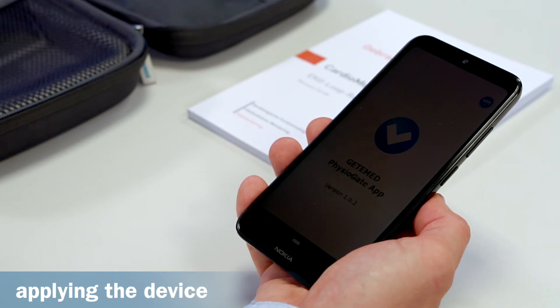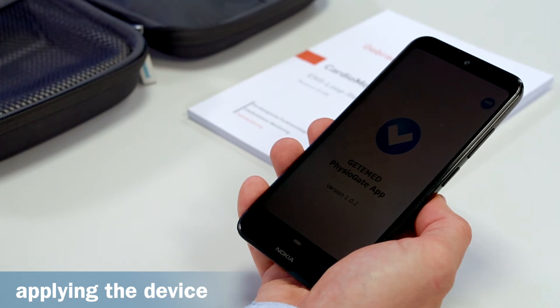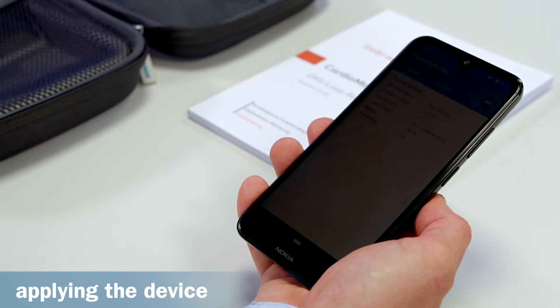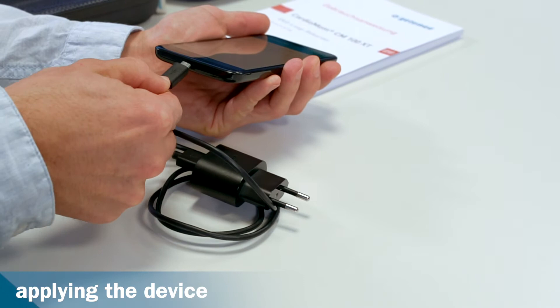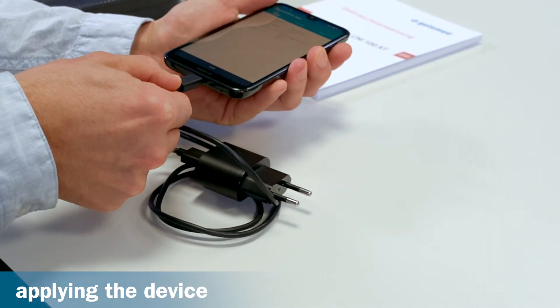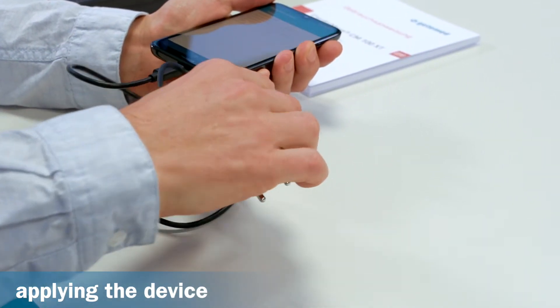The recorder and smartphone are already paired with each other upon delivery and only need to be switched on. Keep the smartphone switched on so that it can receive data from the recorder. Store it in a safe dry place near you, and charge it once a day using the charger cable provided.